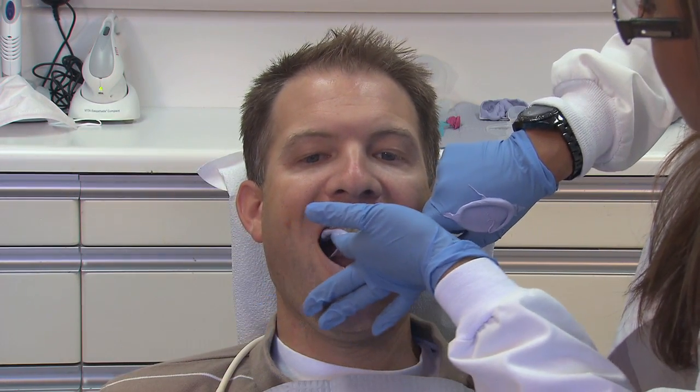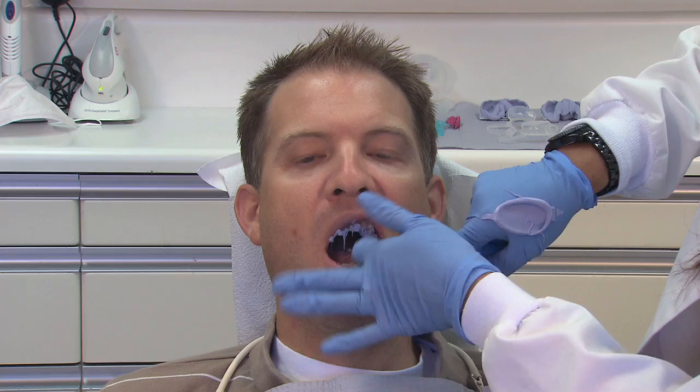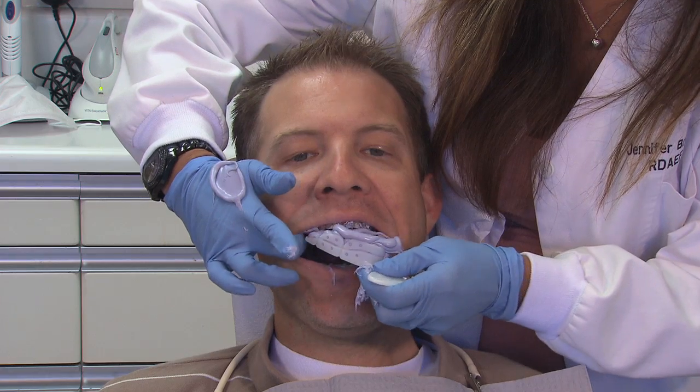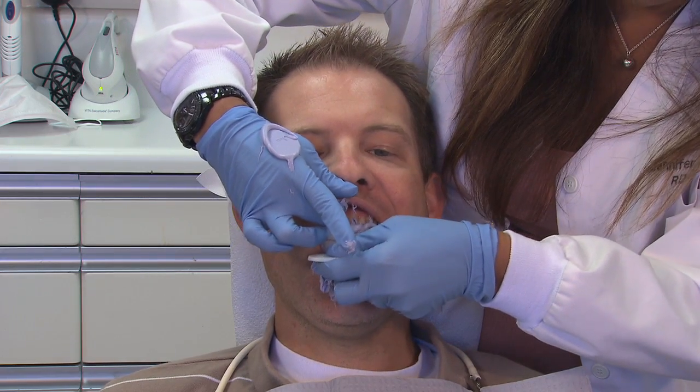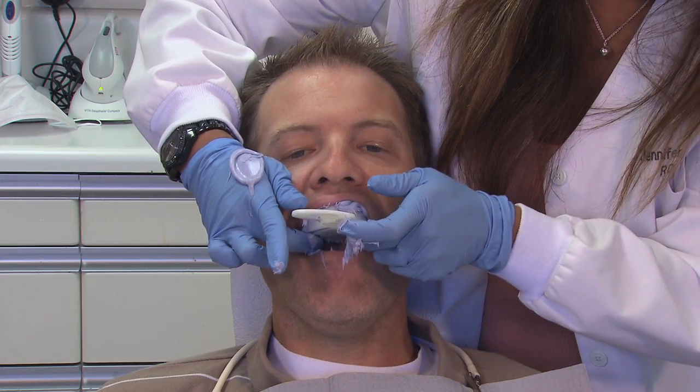The trays always work. They're not stable enough for crown and bridge impressions, but they are stable enough for using an alginate replacement material like we're using here. My assistant's smearing a little on the occlusal surface just out of habit, trying to get the most accurate impression that we can.